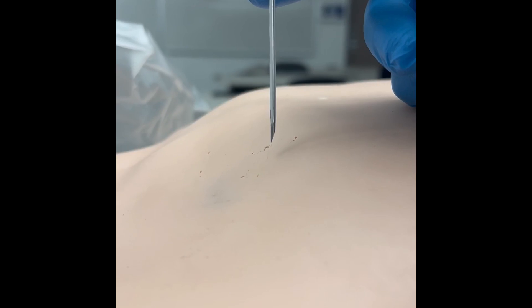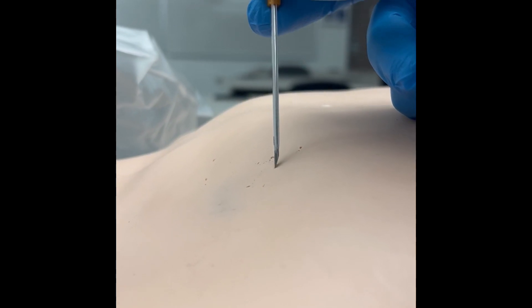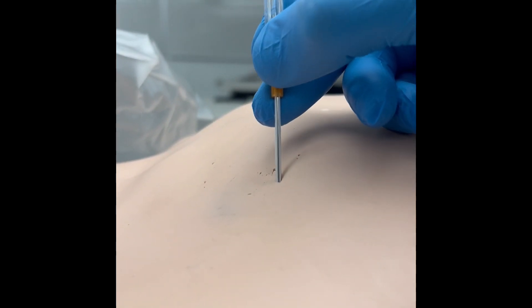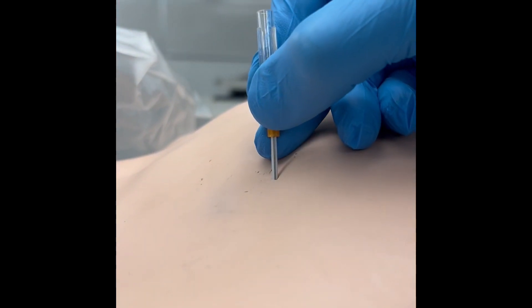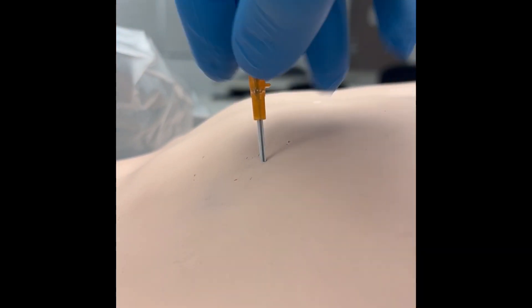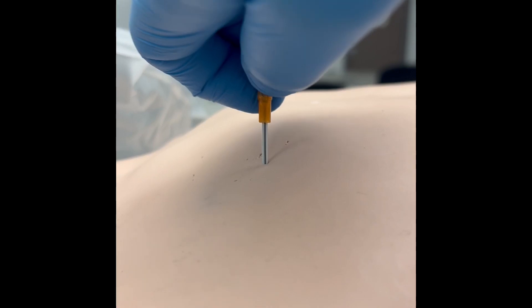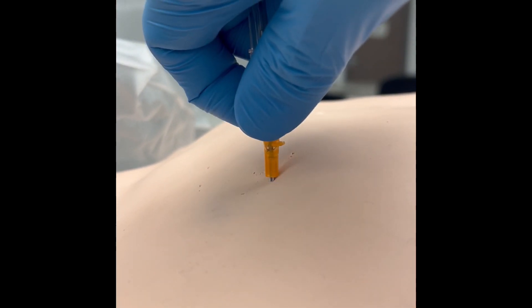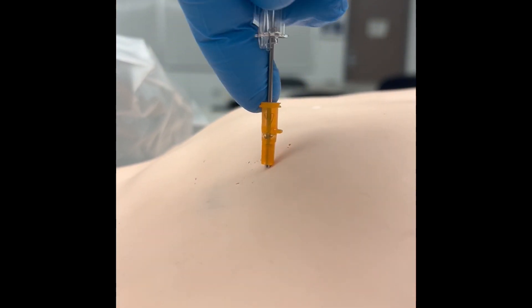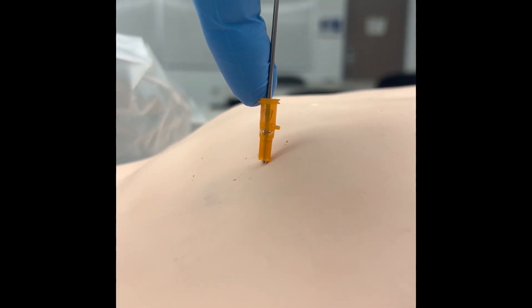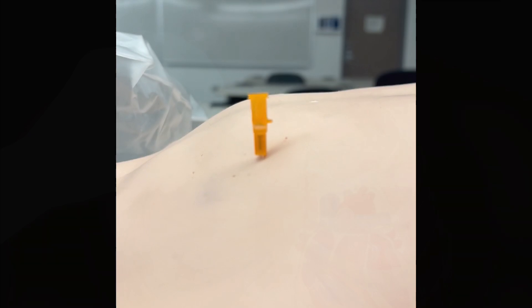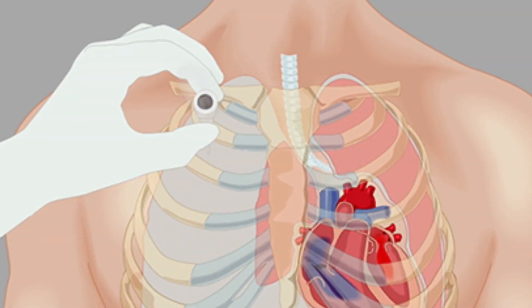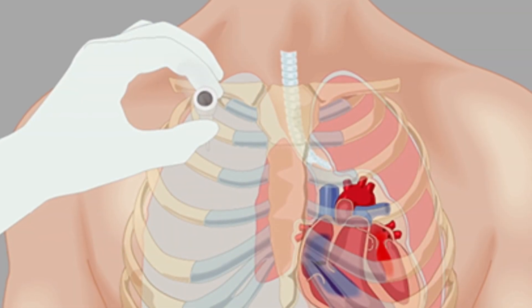Here's a close-up example of the bevel riding the top of the third rib. Advance the IV catheter until you hear the air escape, then advance the catheter until the hub is against the skin. Once you've advanced the catheter, make sure you dispose of the sharp appropriately.